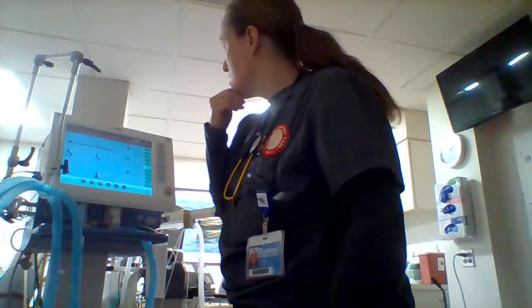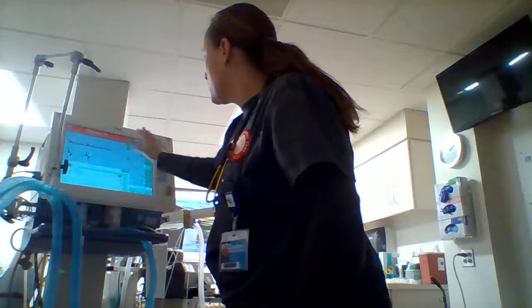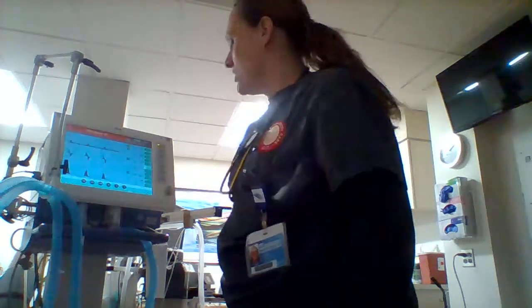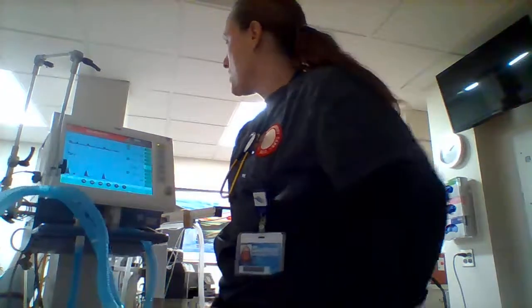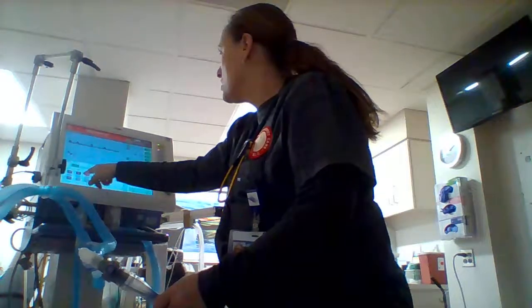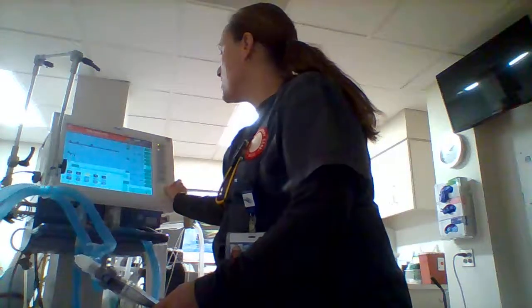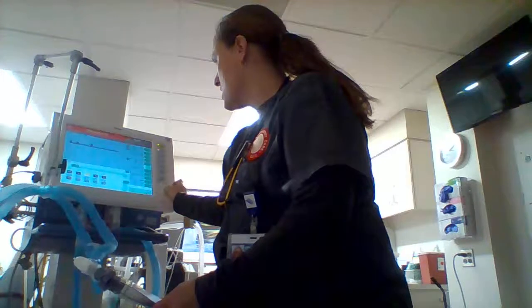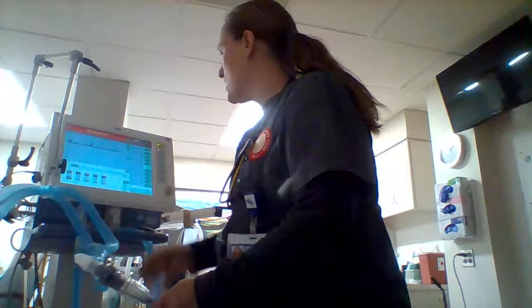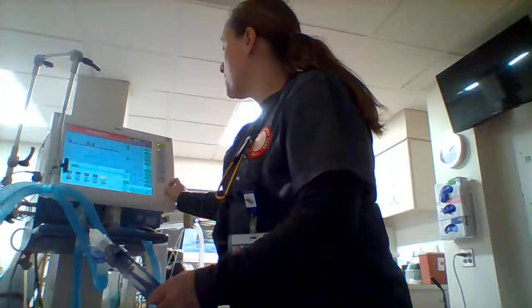I'm going to try to keep her SpO2 around 90%. Let's look at our alarms. High airway pressure set to 40, high tidal volume to 550 — that'll work. I also have the option to change up to 15 based on protocol.